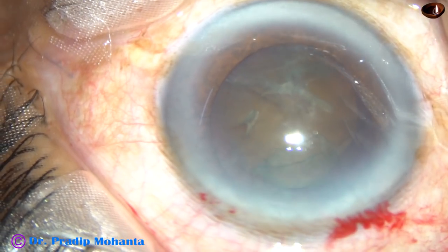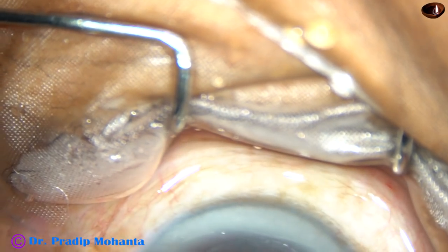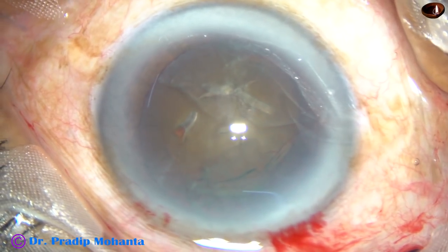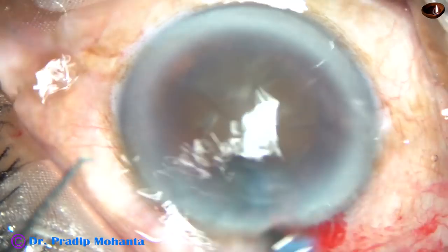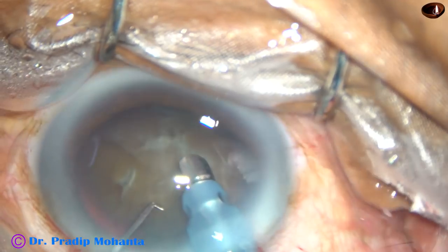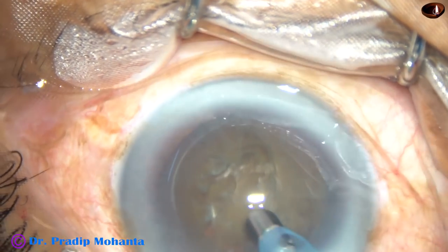Now viscoelastic substance is again injected, and we are going to manage this hard nucleus. Don't wish it were easier — wish you were better. Don't wish for less problems — wish for more skills. Don't wish for less challenges — wish for more wisdom. This is a quote from Jim Rohn, a famous American motivational speaker.